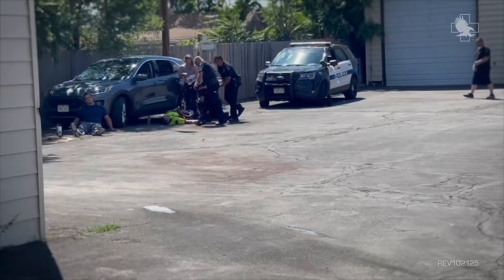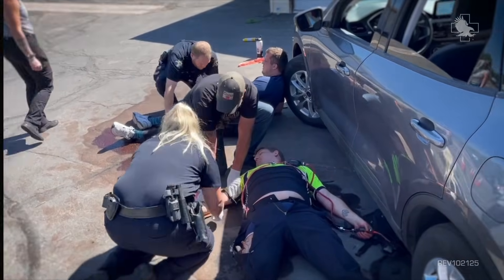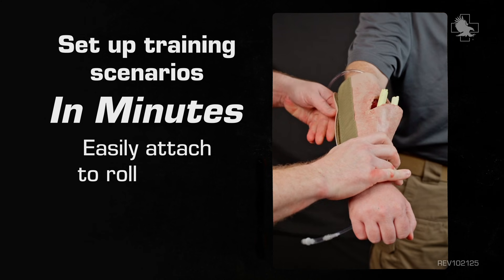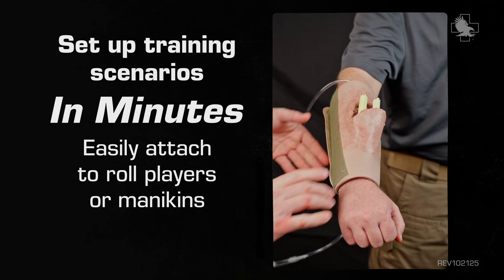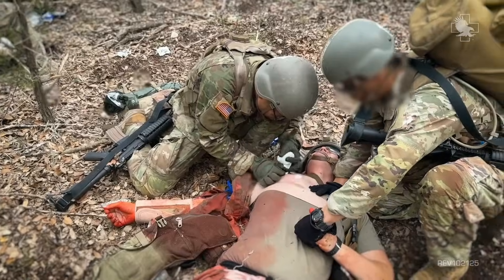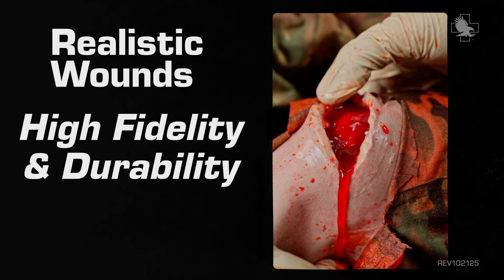The SMRT system is made to solve your unique training needs without introducing unnecessary complexity. Set up training scenarios in minutes with wounds that easily attach to role players or mannequins. Combine multiple wound patterns to build fresh simulations that fit the real world. Train on realistic wounds which give you both high fidelity and durability.